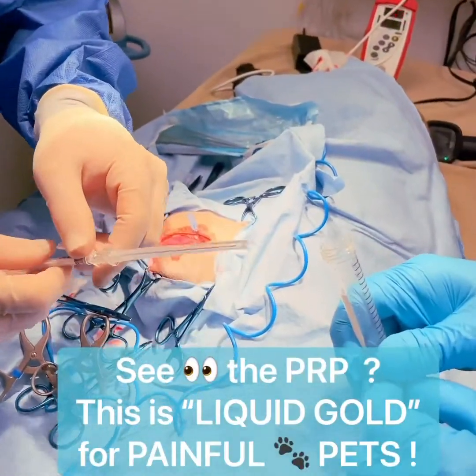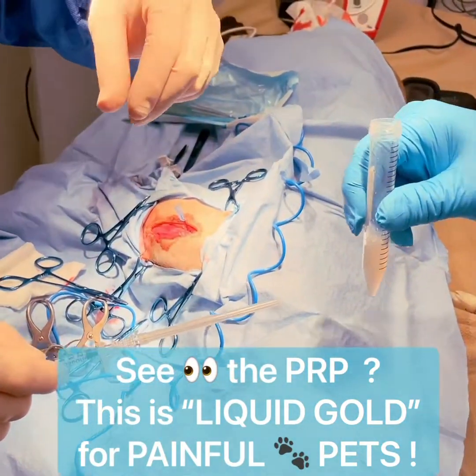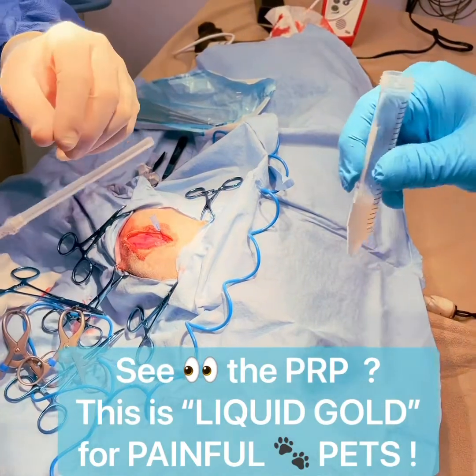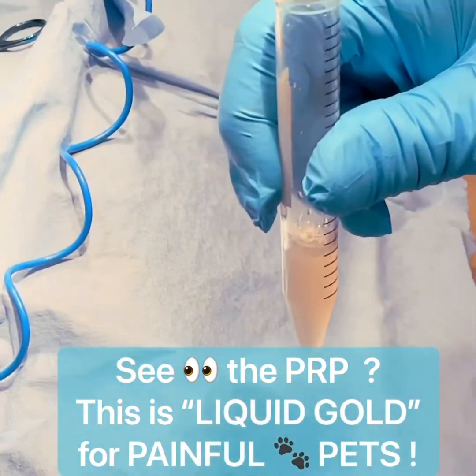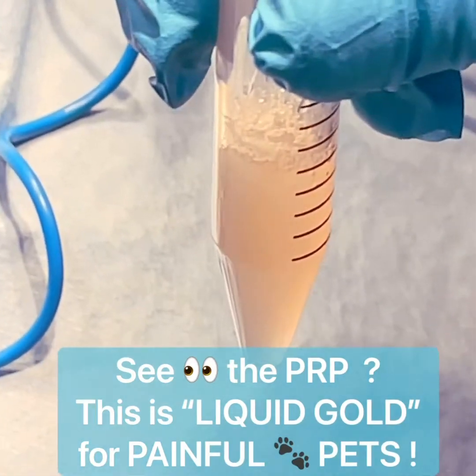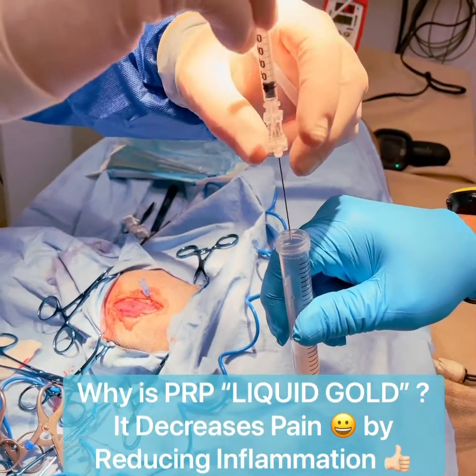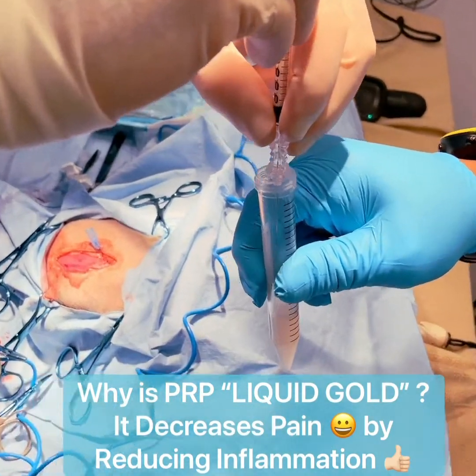This is the prepared platelet-rich plasma. As you can see, it's viscous — there's a big jelly there. The jelly is actually the outer layer of the platelets that have popped, and what we're going to do is get the liquid portion, which is the platelet-rich plasma. That is where all the good stuff is.